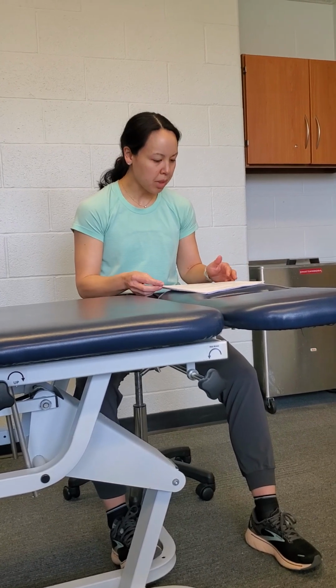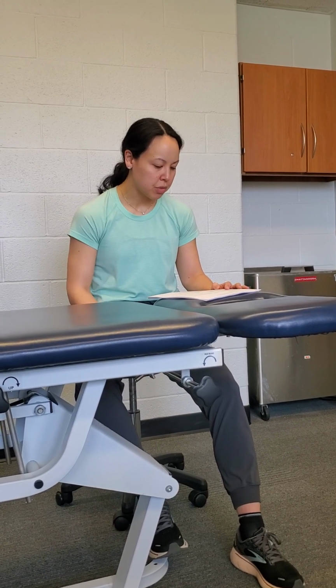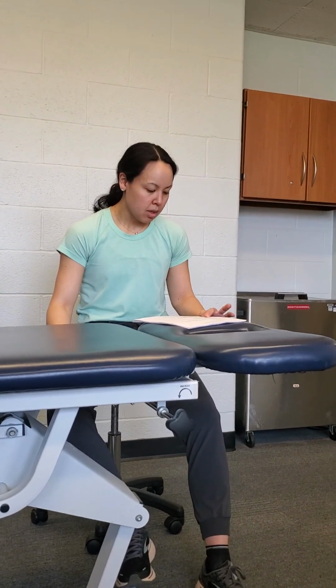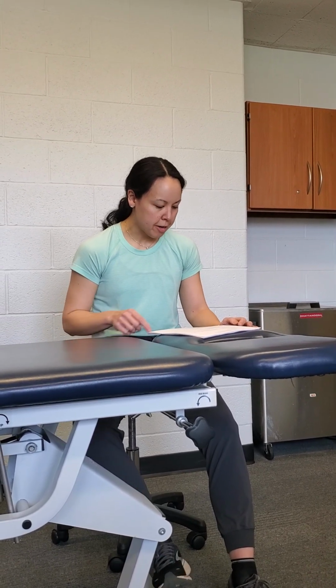Okay. And then it says when to use BFR. We can use it very early in the rehab to limit atrophy and restore and maintain muscle quality, to hit multiple targets in older clients, on days where pain might limit exercise, to reduce pain prior to loading heavy, as a light day in a rehab block, as a finisher to ensure sufficient volume, or as a means of maintaining general fitness.